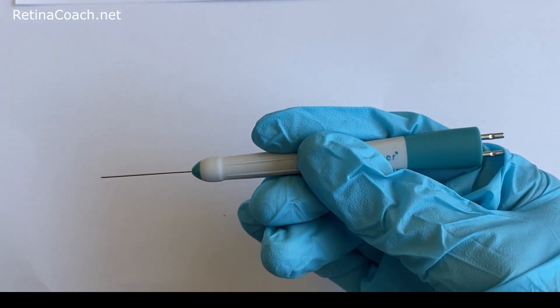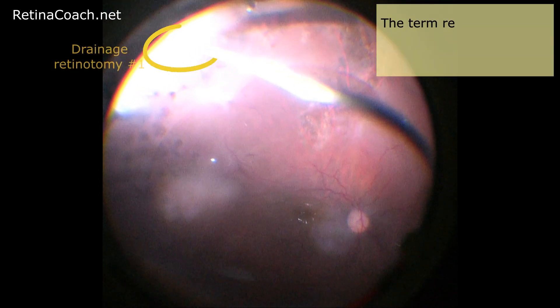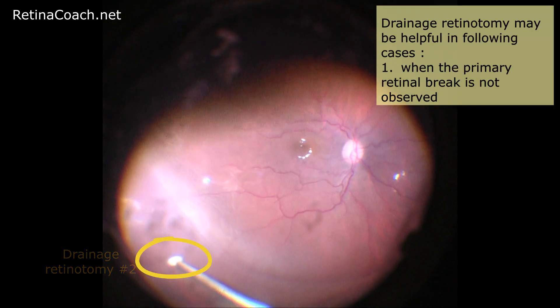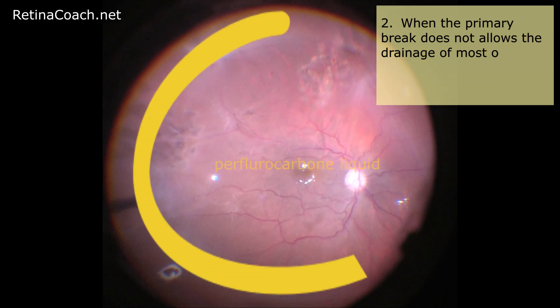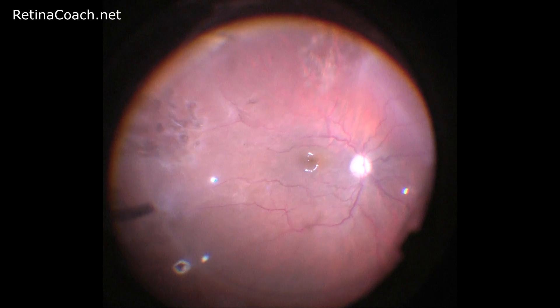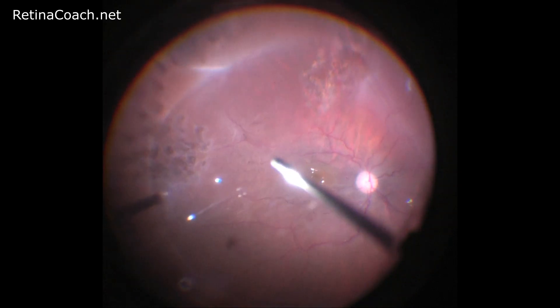Another advantage of bipolar diathermy is minimal tissue damage around the area of coagulation. The term retinotomy means cutting the retina. Drainage retinotomy may be helpful in the following cases: when the primary retinal break is not observed, when the primary break does not allow the drainage of most of the subretinal fluid — for example, in long-standing retinal detachment where subretinal fluid becomes viscous and is hardly removed.